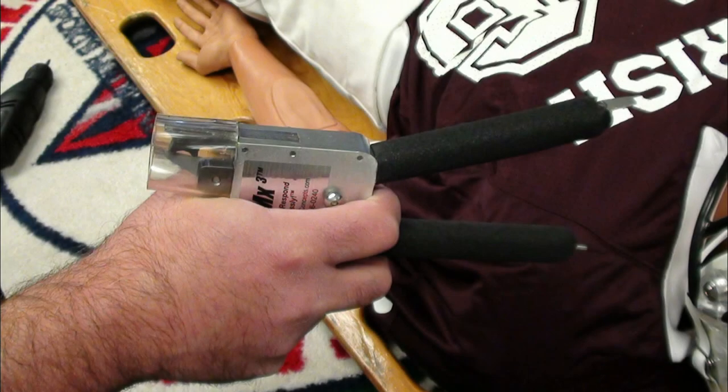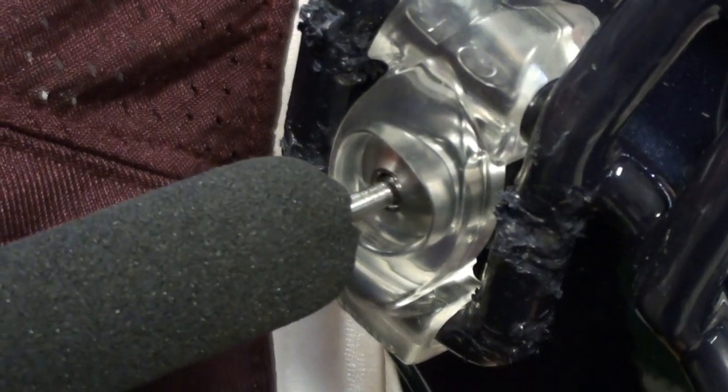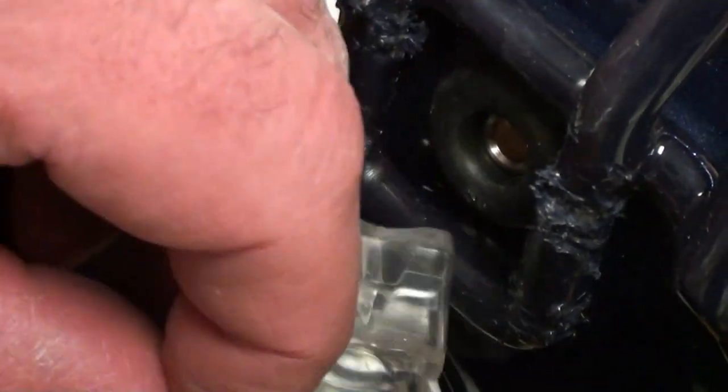The FM extractor handles contain an end effector specifically designed to activate the Riddell quick release hardware. To use the FM extractor quick release end effector, leave the blade safety protector in place while using the pistol grip hand position. Insert the quick release nub of the FM extractor into the quick release fastener button and depress the button fully. With an up and out motion, use the FM extractor quick release nub to help draw the quick release hardware out of the bowtie fastener while simultaneously pulling the entire fastener away from the helmet.